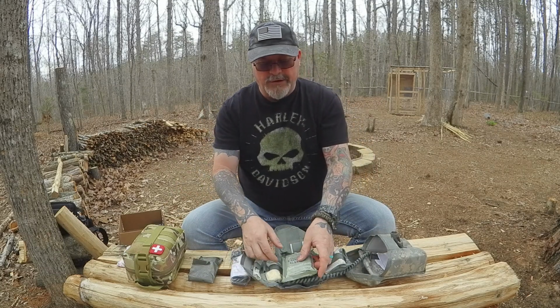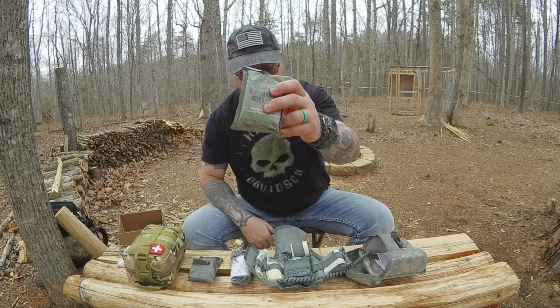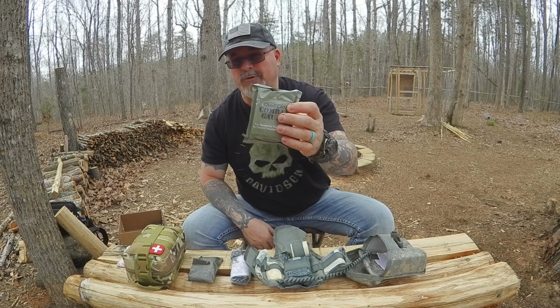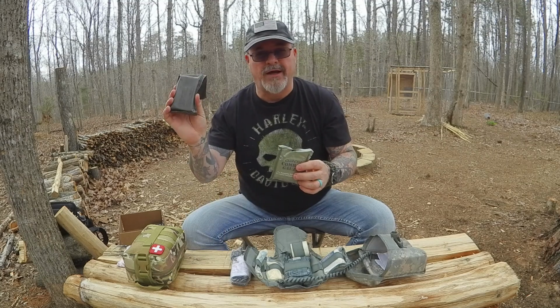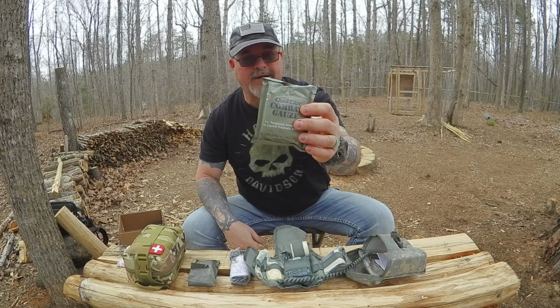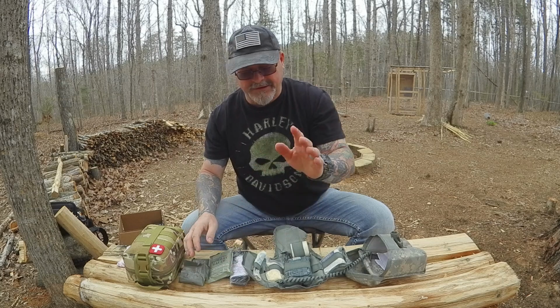And then in here, you've got your QuikClot combat gauze, which is awesome stuff. This stuff will stop bleeding like crazy, and it's awesome to have. But these QuikClot bandages aren't that cheap. So you can get compression bandages that aren't QuikClot. And what we used to have is stuff like this. This is a non-QuikClot one. So the difference is this doesn't have QuikClot, this does. And these are amazing, and I do recommend you having these in your kit if you can afford them, but it's not cheap to get this stuff. So you can go with these and be just fine as well.